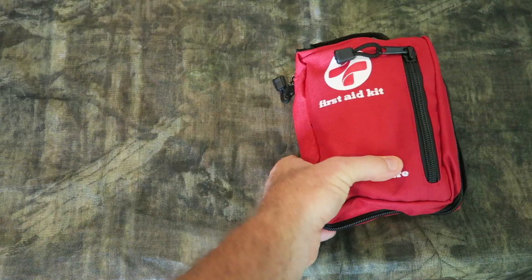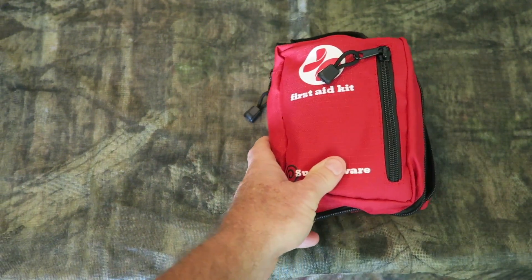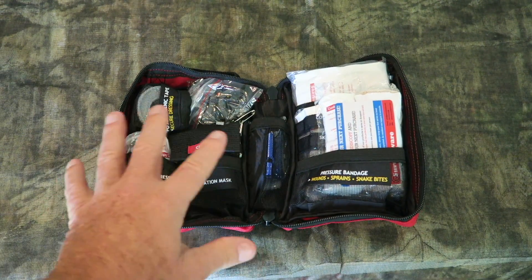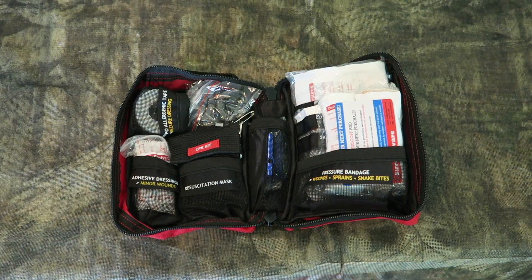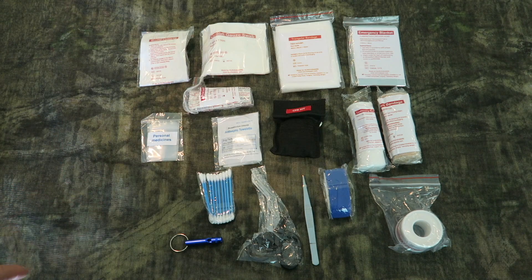As far as the weight goes, I'll probably weigh it, but it's not too bad. I believe you could stick this in a backpack. It's so well organized that I really don't want to take everything out, but because I am reviewing this, we're going to take everything out and lay it out. Wow, look at this thing — there is just so much stuff inside this kit.